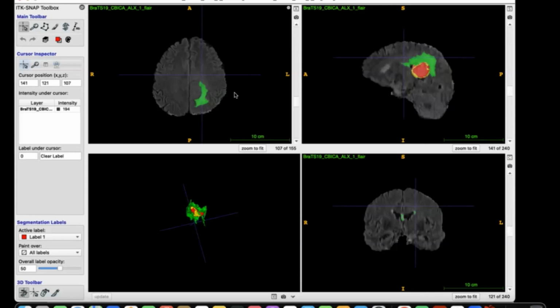Actually, we're going to implement code to build an algorithm to do the segmentation using deep learning techniques. So this tool is more for you to visualize the data and get familiar with what these data look like, and give you an idea of what a tumor looks like and how it is distributed in this particular data modality.